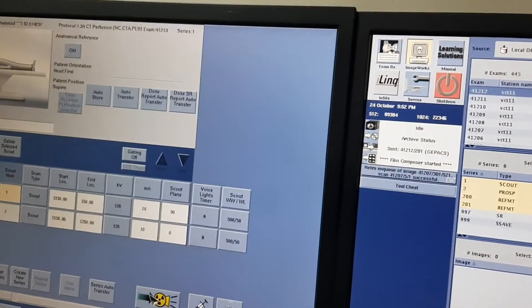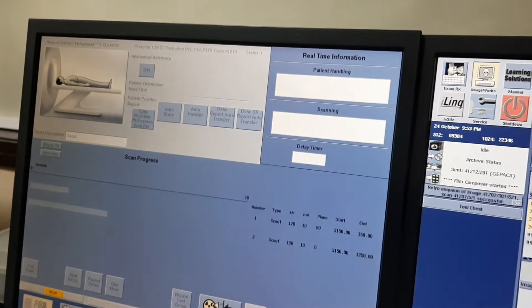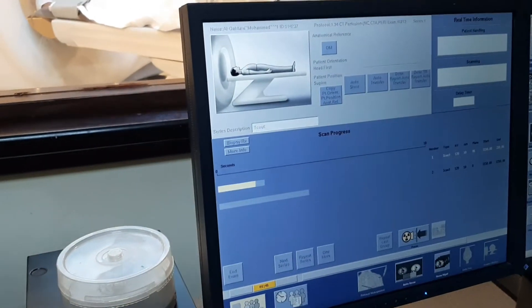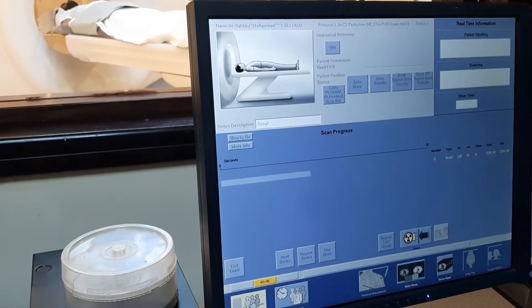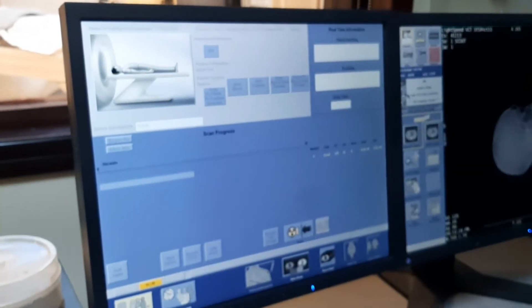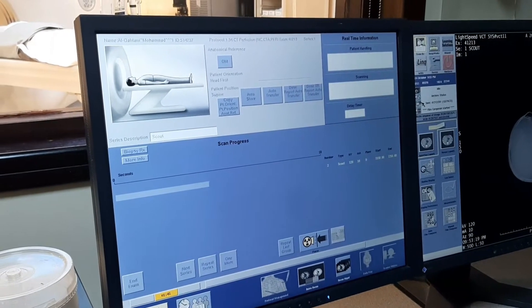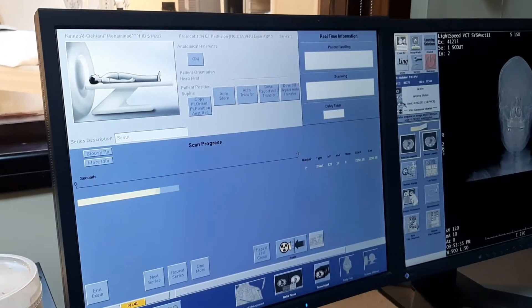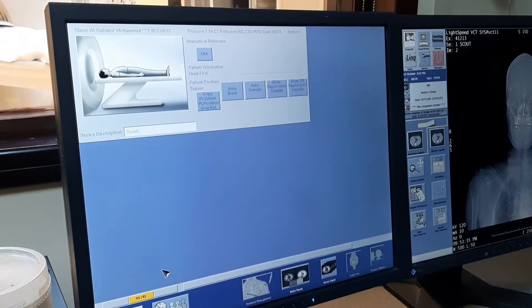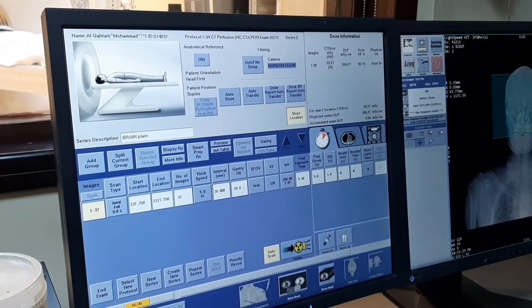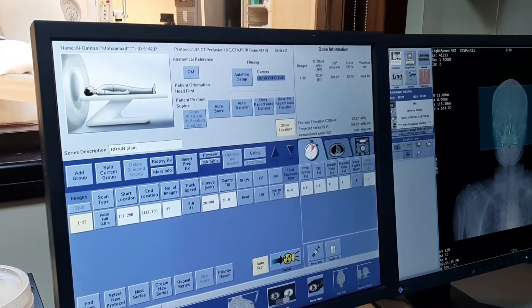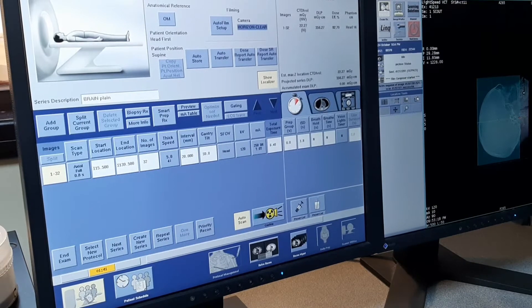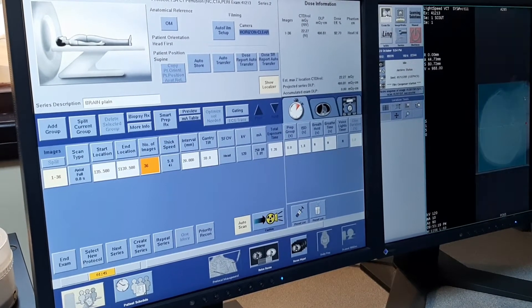Now, same with the brain. For the lateral, it will include until the neck. Go ahead. Now plan the same with the brain — brain only. Don't include the neck. The same with the brain. Plan the same with the brain.